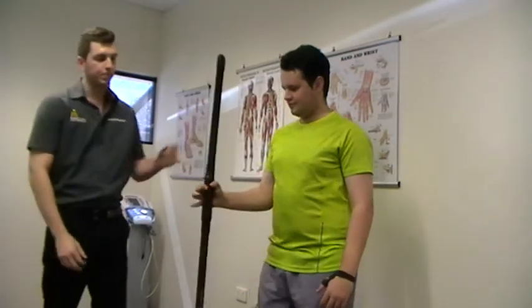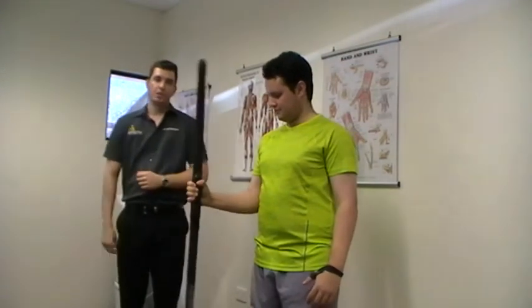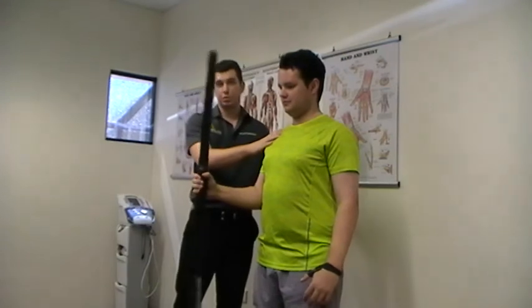So Jordan, can you hold that by your side for me? What I'm going to get Jordan to do is wobble it from side to side. As he's wobbling it from side to side, his shoulder muscles are working to strengthen and he's having to stabilise his shoulder blade at the same time.